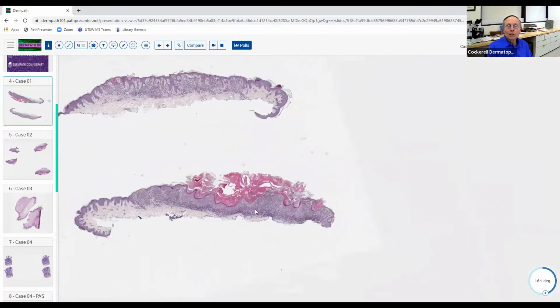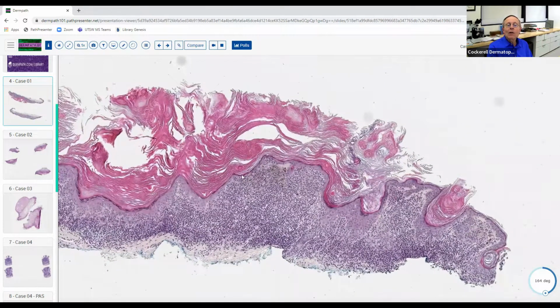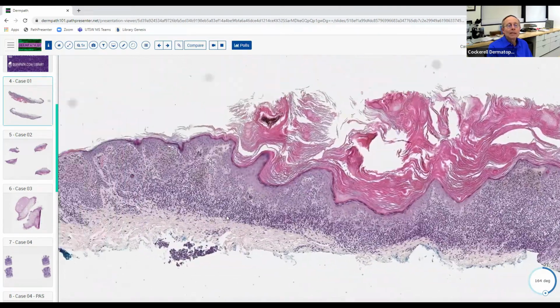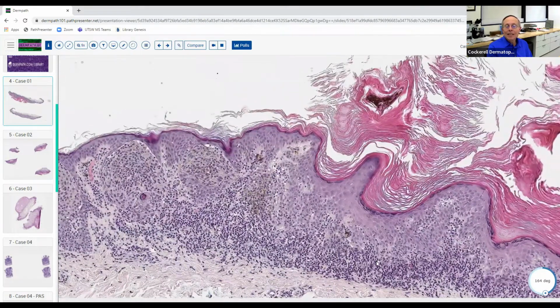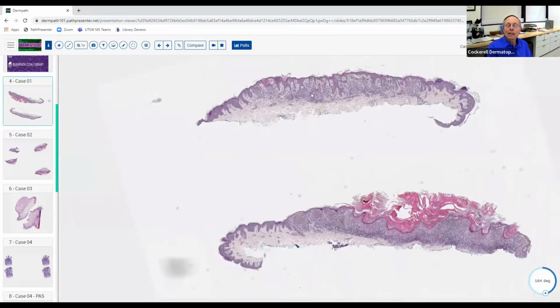They get this really super dense infiltrate. This is sort of a red herring. They don't usually get this acanthotic epidermis that looks like a seborrheic keratosis. That's an unusual finding. But when you see halo nevi, they get such a dense inflammatory infiltrate. It's usually, like you noticed, relatively well localized like this. It almost has a lichenoid type morphology, and usually a relatively flat base of the inflammation.